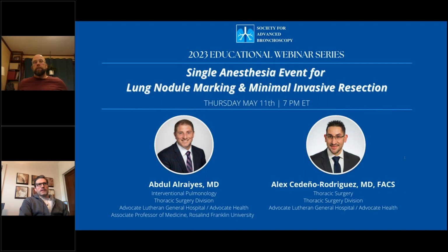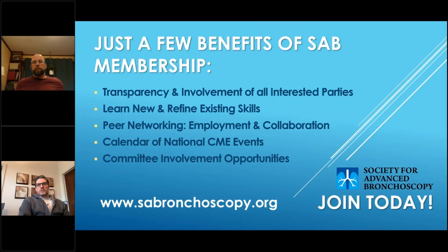I also want to come back to one of your points about when your catheter was past the lesion, saying I don't need to have my catheter sitting directly on the lesion. Sometimes it's better to be 1 or 2 centimeters off of it and rely on my tool, again, because you can track your tool going into the lesion. And there are times, as we all know, that you can be too close. Too close sometimes isn't the right place to be.